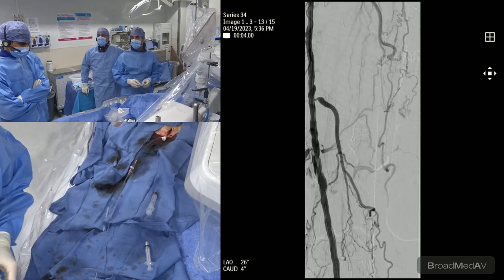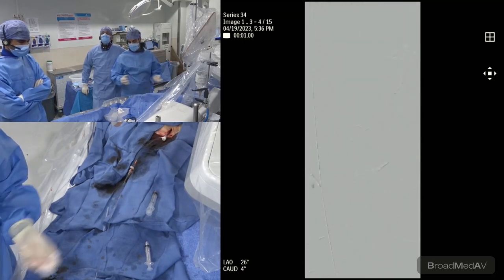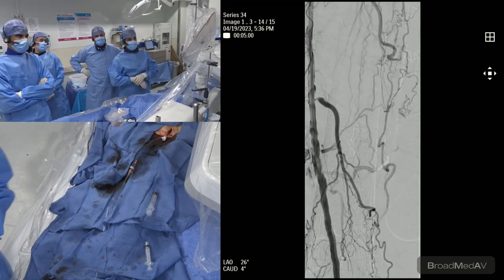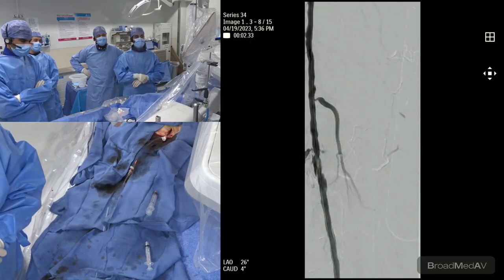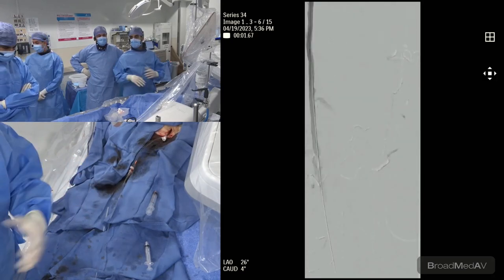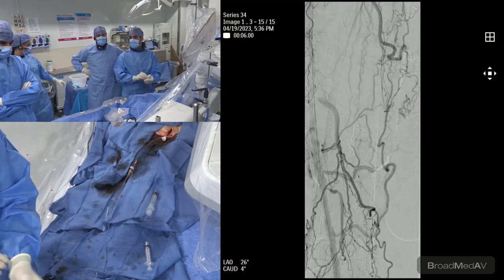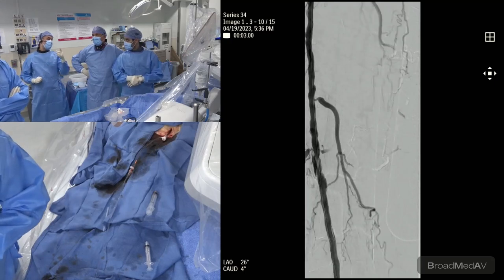I feel that the 70%, 72% at 5 years patency for IMPACT is pretty good. But I think that a difference of a few percentage points between Eluvia and Zilver at 1 year may not be the strongest evidence to choose one over the other, although it is statistically significant. Correct. But the question is what happens at 5 years, and we know the answer with one, and we don't know with the other. Well, we have TLR data with IMPACT, not patency data.